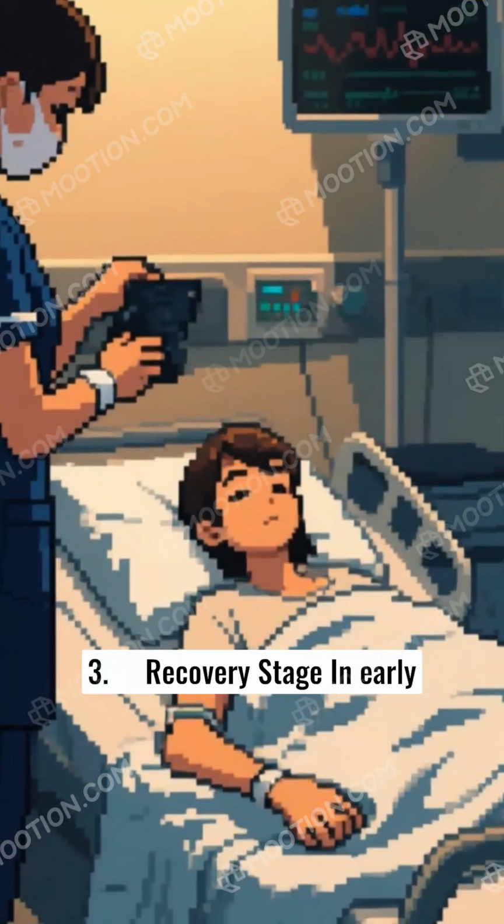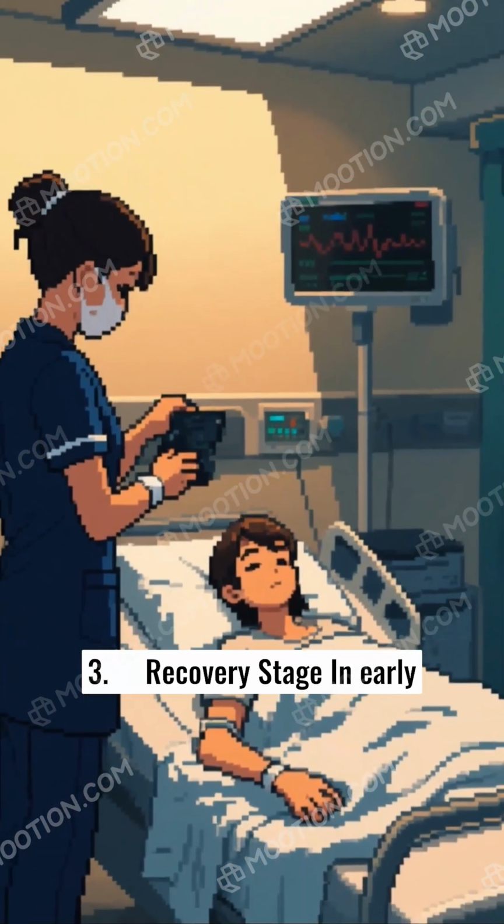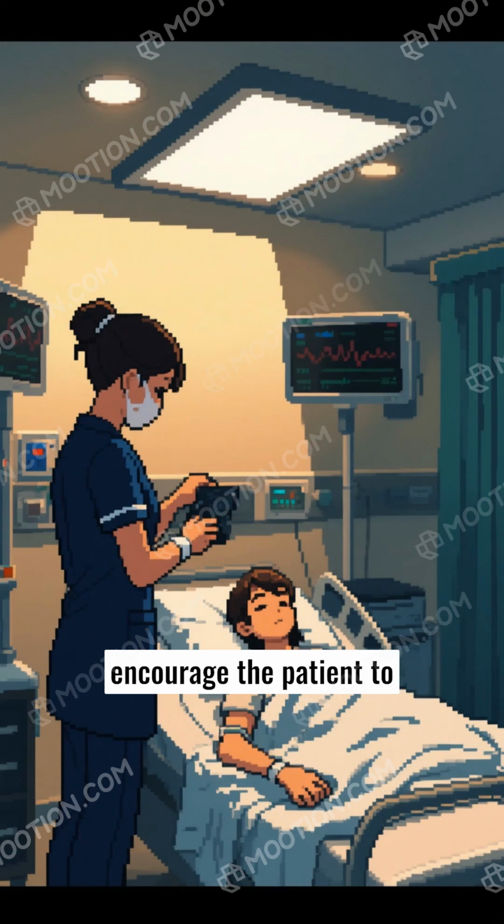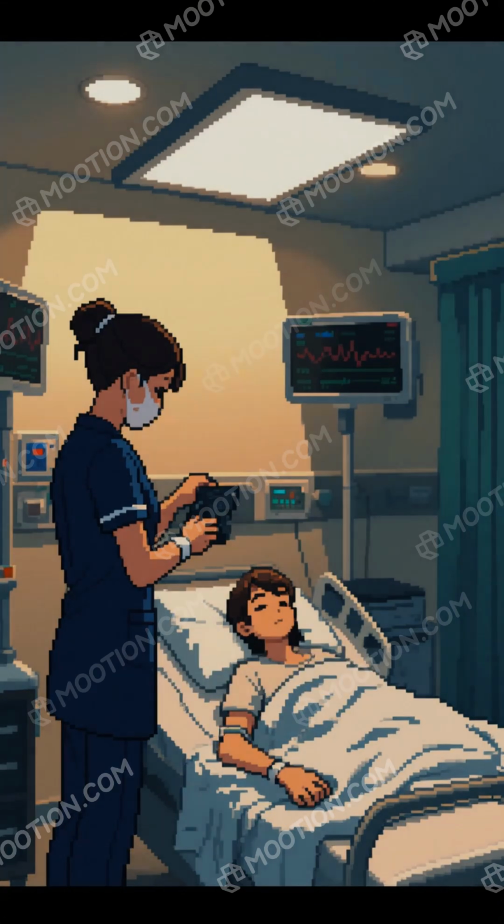3. Recovery stage. In early stages, patients may need full support. As they improve, the ventilator gives partial help to encourage the patient to breathe on their own.